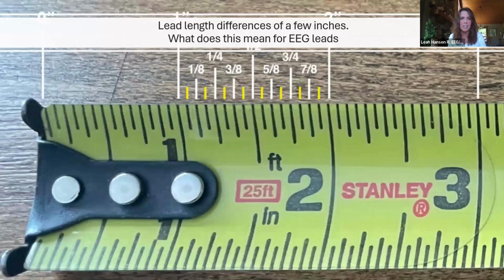You go back to your manufacturer or supplier and say, hey, what's the clearance parameter for strength? And the reality is, unless that manufacturer has cleared and tested it as an MR conditional 9T product, even if it's very safe on a 3T, even if you're sure it's going to be fine on the 9T, it cannot be used in a 9T setting if it hasn't been cleared under that condition.